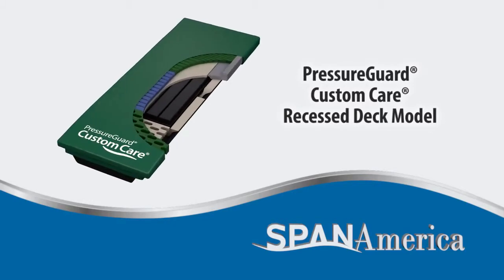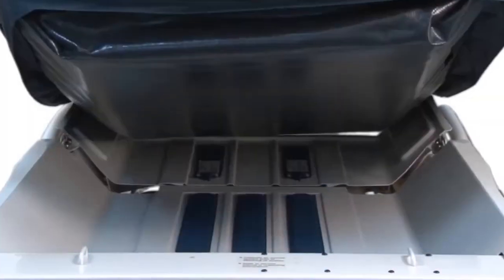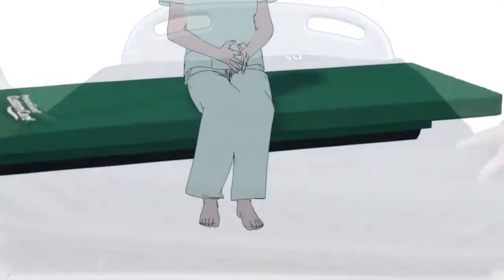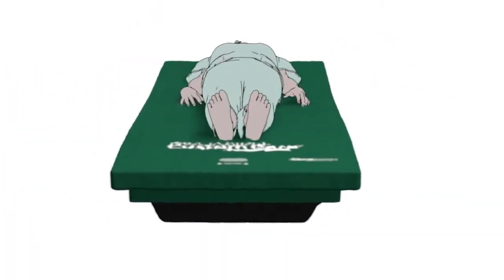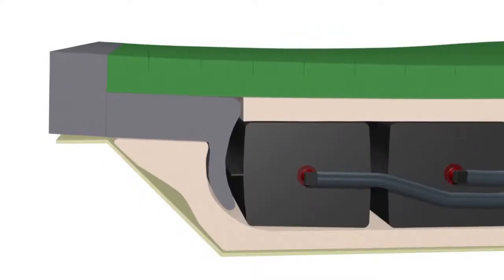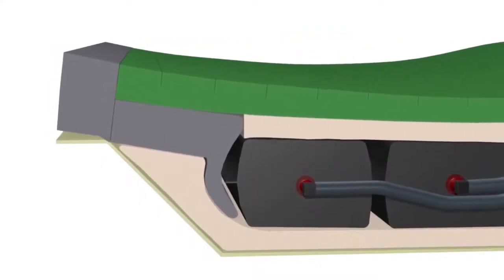Our Pressure Guard Custom Care recess deck model is one of a series of SPAN surfaces that accommodates the unique challenges of the recess deck bed design. These surfaces bring a combination of proven therapeutic and safety features to recess deck beds.